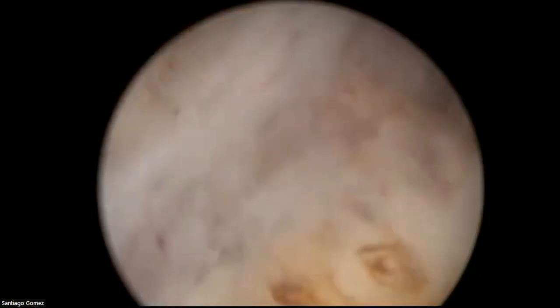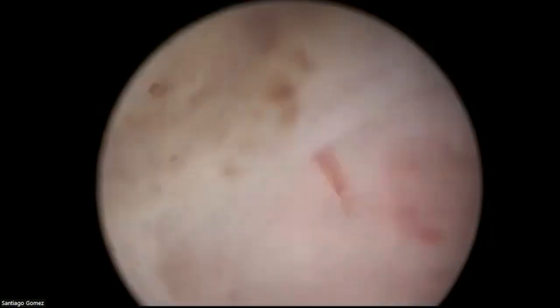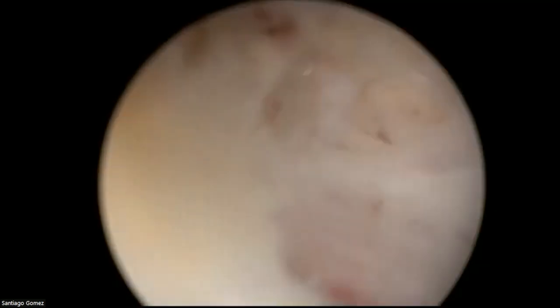When you touch the tissue with a Storz instrument, for example, you don't see very well because the lens is going all the way out to the surface or the external part of the tip, and so the tissue is going to block the view.